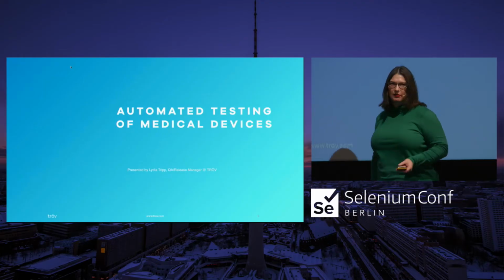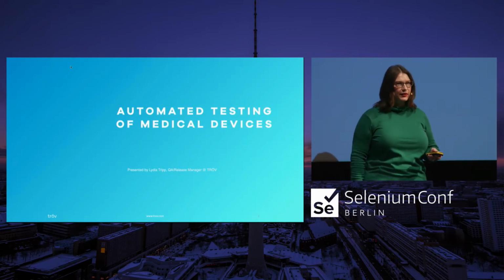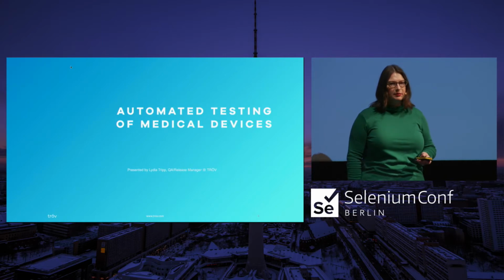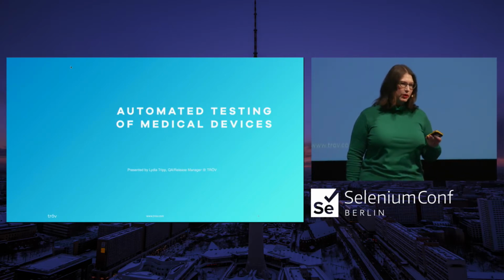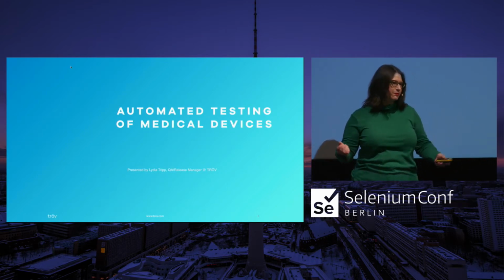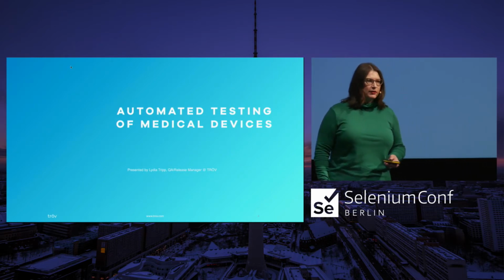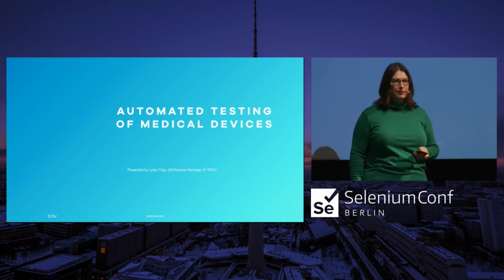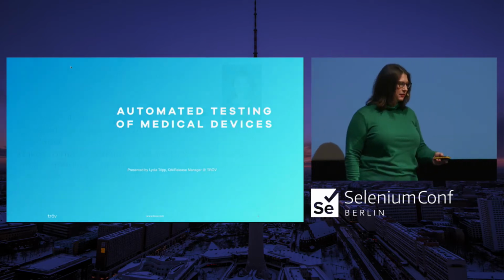So I'm going to talk about automated testing of medical devices. For the purposes of US medical devices, software that interfaces with a medical device is considered to be a medical device. So if you're writing an application that works on iOS or Android, or even a web page that perhaps has something to do with how your IoT medical device functions, it is indeed a medical device. And you have to conform to the testing standards.